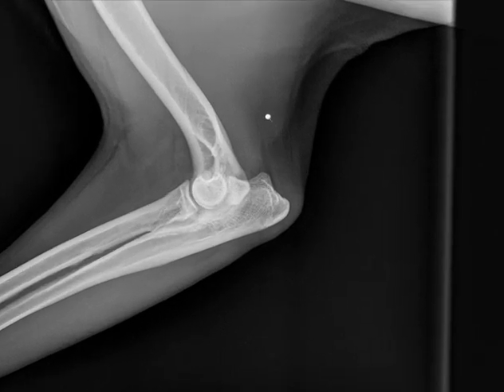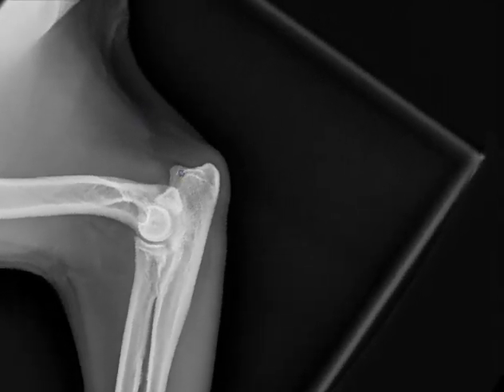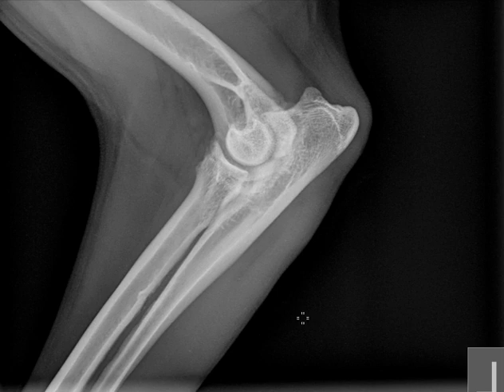This is the lateral view of the right elbow. You'll note that when we trace the radiographic joint space along the elbow, you can see that there's the impression of potentially a step here, where the distance between the radius and the humerus is slightly different than the distance between the ulna and the humerus, creating what we call a step at the bottom of the joint. This can be difficult to assess and confirm radiographically, and even with CT, our assessment of this can be inaccurate.